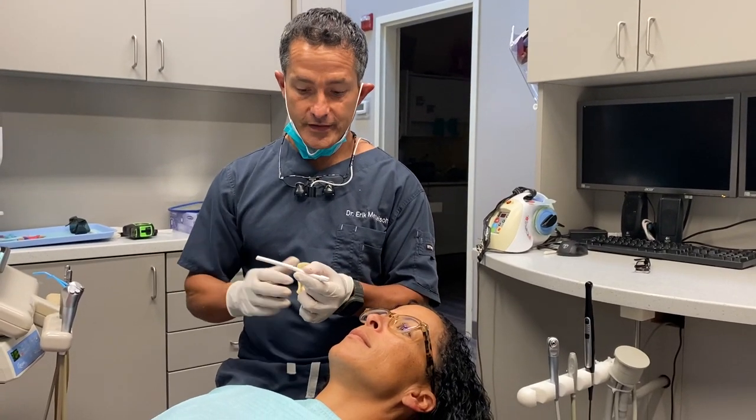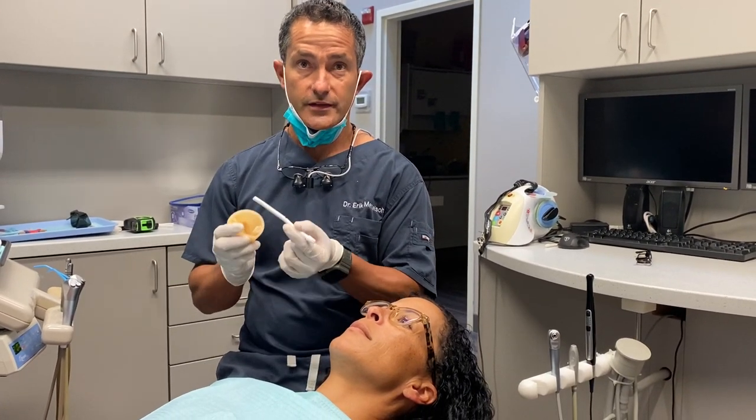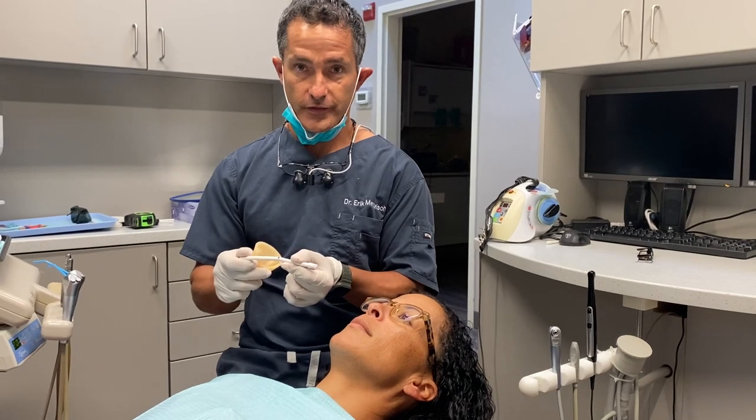Hi, I'm Dr. Eric and I wanted to show you how we use and insert the Solovac.